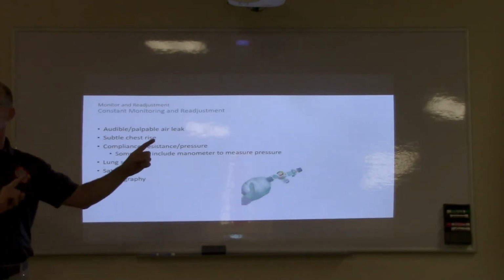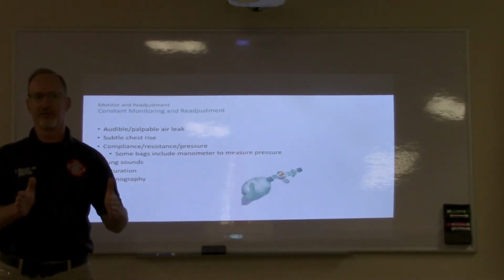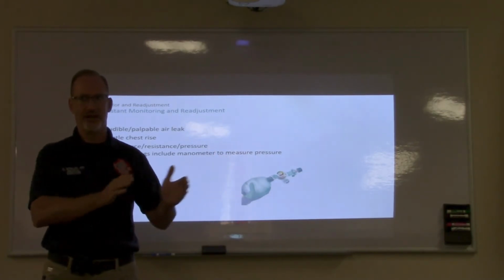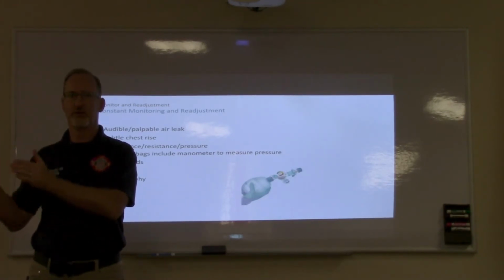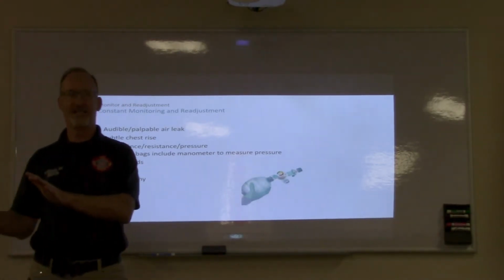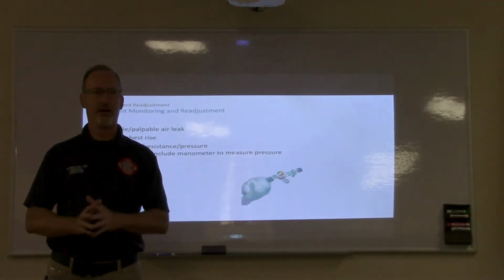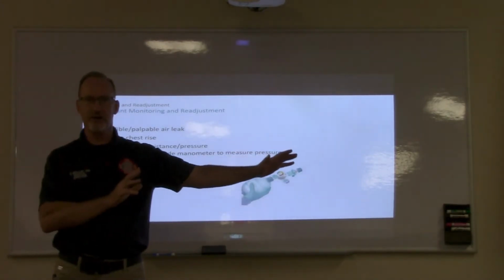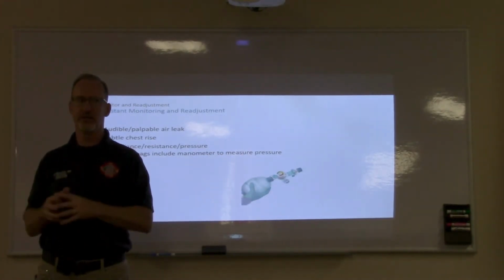As an aside, tangent alert, non-rebreather for cardiac arrest. Who gets the non-rebreather when you show up, and who should get mask ventilation from the first second that you get there, assuming that you have enough hands and you're not just trying to put an AED on or start compressions? Let's just say you walk in with 4 or more people, and you have hands. Which cardiac arrests should we be bagging right away? Which cardiac arrest should get a non-rebreather?